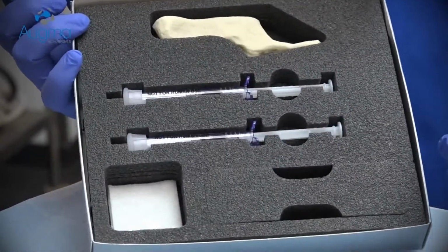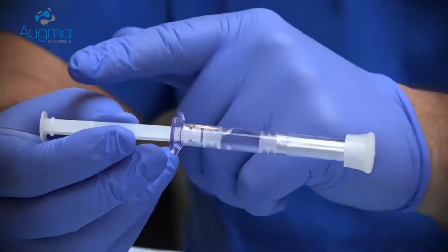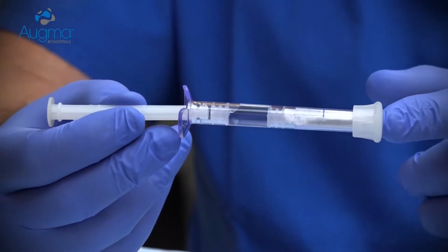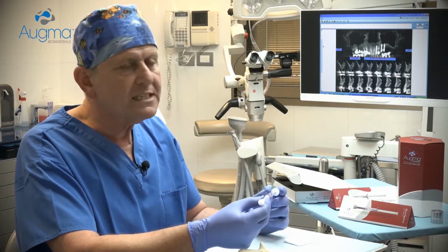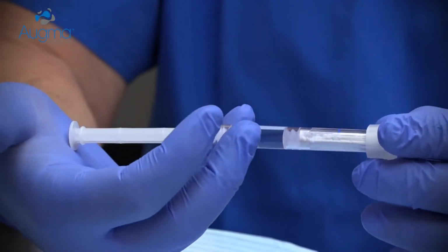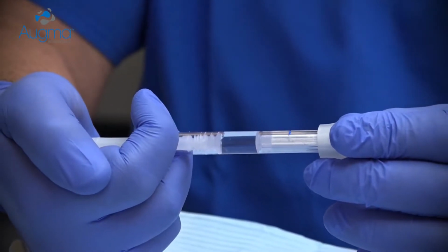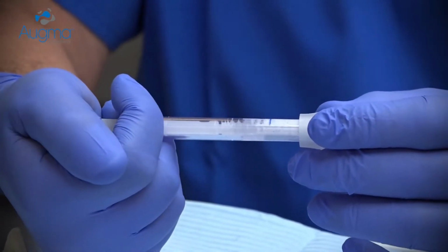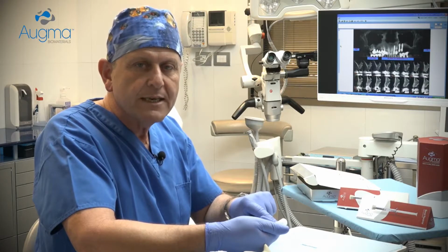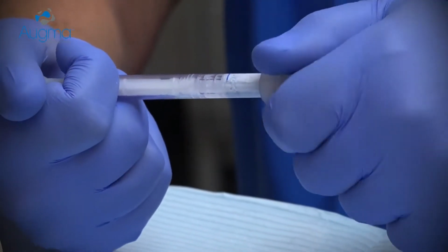So let's get started. This is the Bond Apatite syringe. It contains the powder, the liquid, a shaft, 2 pistons, blue indicating line, and the syringe cap. Now, in order to activate the material, all you need to do is push the shaft against the palm of your hand and start pushing the piston until the first one reaches the blue line. At this stage, the material gained the right viscosity and is ready and prepared to be placed in the grafted site. Now, remove the syringe head.